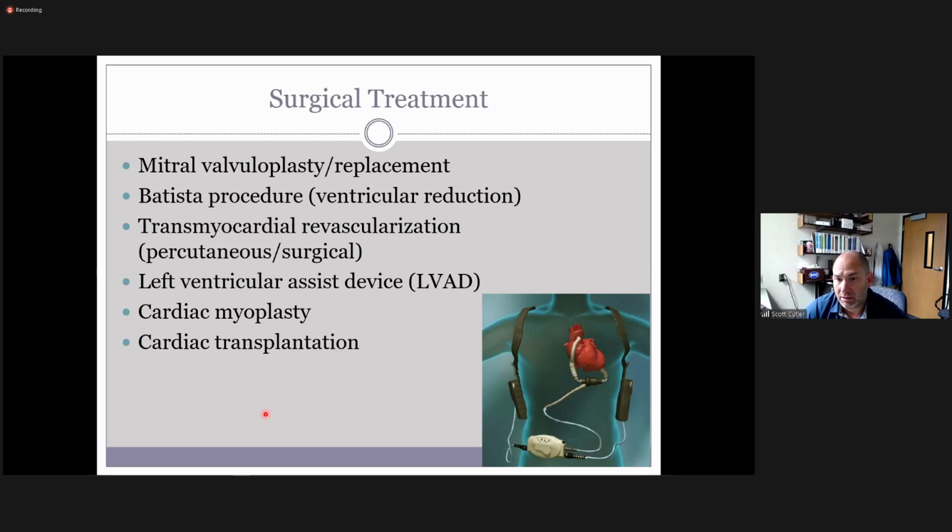You might see tenting. It's doubtful you'll see prolapse, but you could see the leaflets coming apart, you may see them not actually touch, you may see them tenting, remember where it just touches the very, very tips. So those are clues. Again, dilated cardiomyopathy is going to stretch the chordae tendineae, which don't allow the valve to shut properly. Remember, if it's a dilated cardiomyopathy, we're also looking at the valves to see that it's not a valvular cause, so we're distinguishing them from other dilated cardiomyopathies.